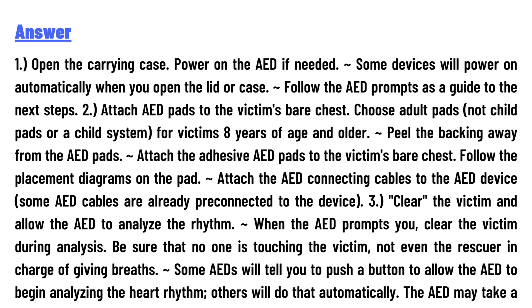Step 2: Choose adult pads, not child pads or a child system, for victims 8 years of age and older. Peel the backing away from the AED pads and attach the adhesive AED pads to the victim's bare chest, following the placement diagram on the pad.